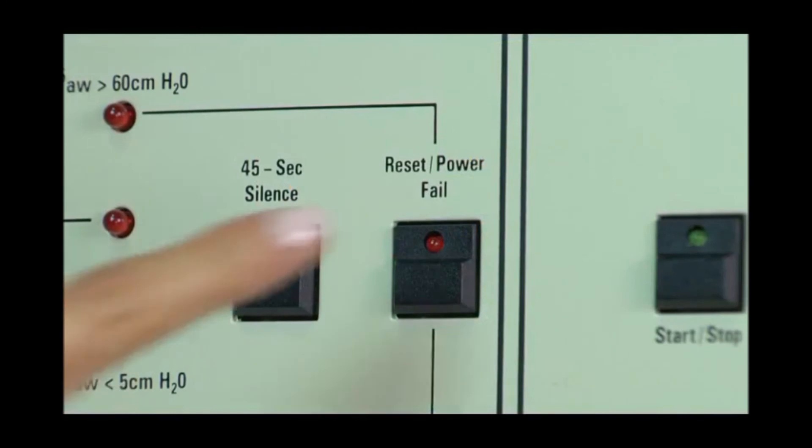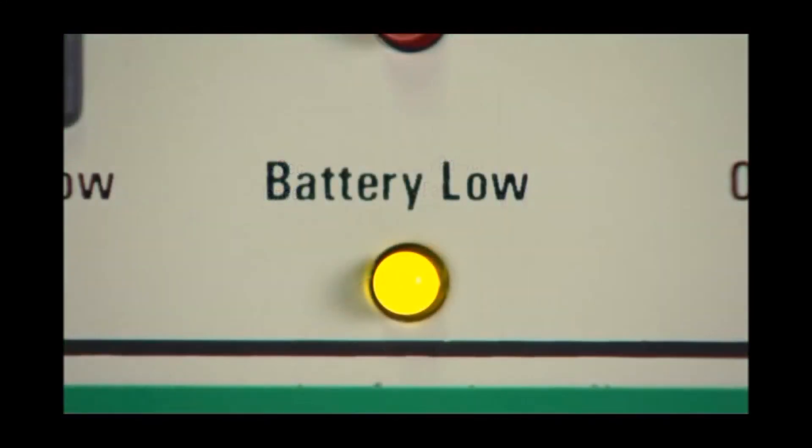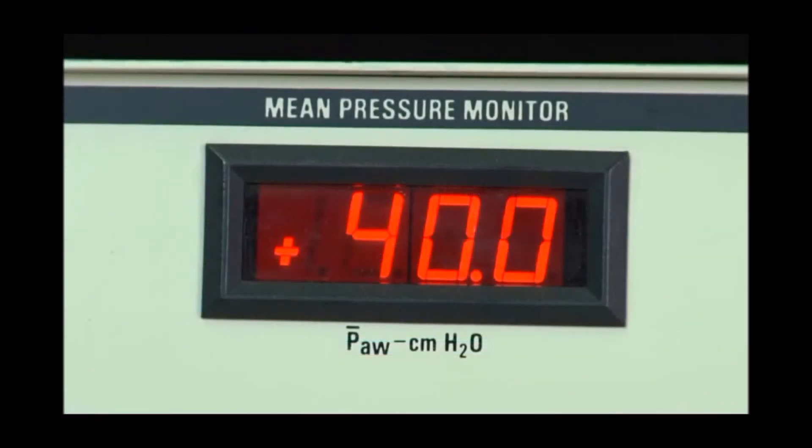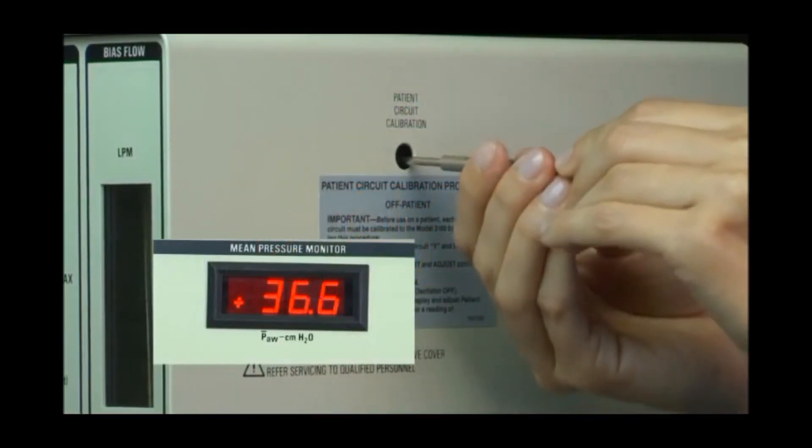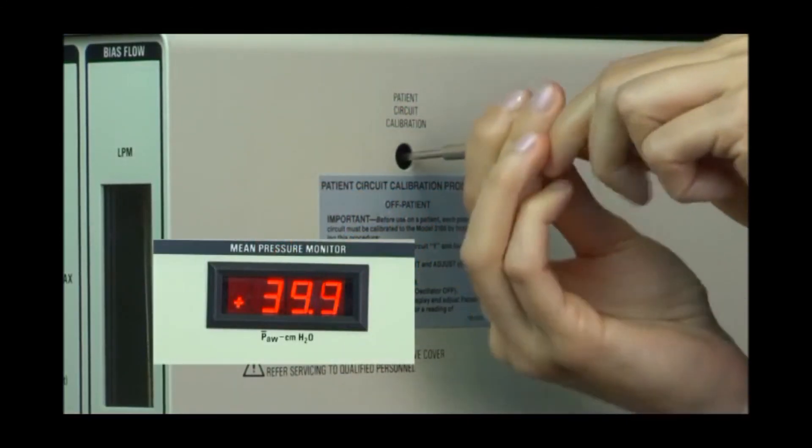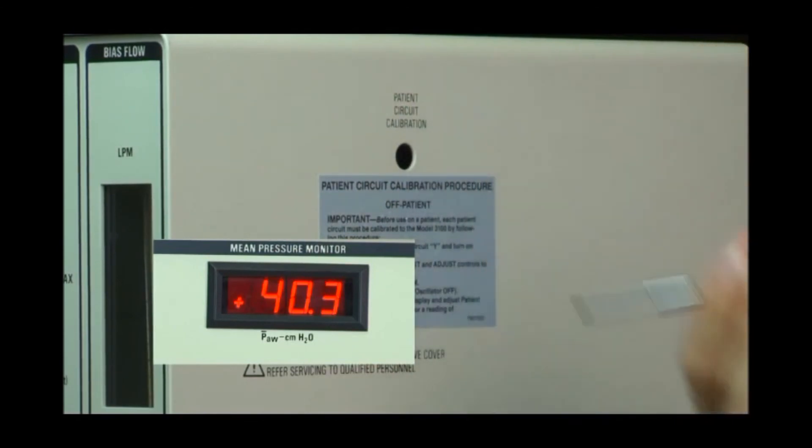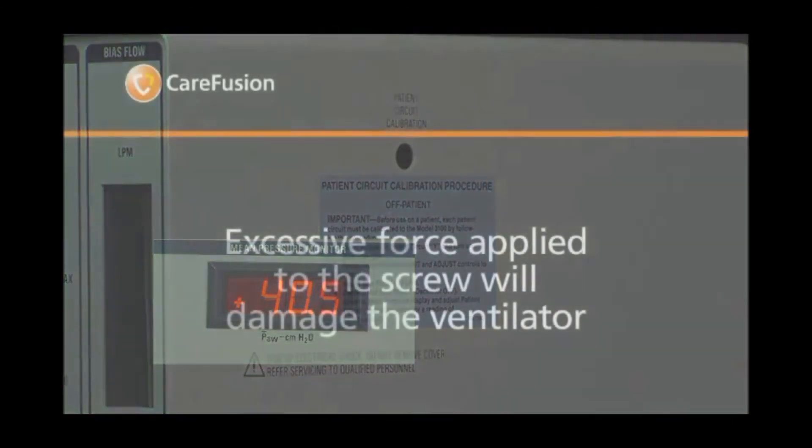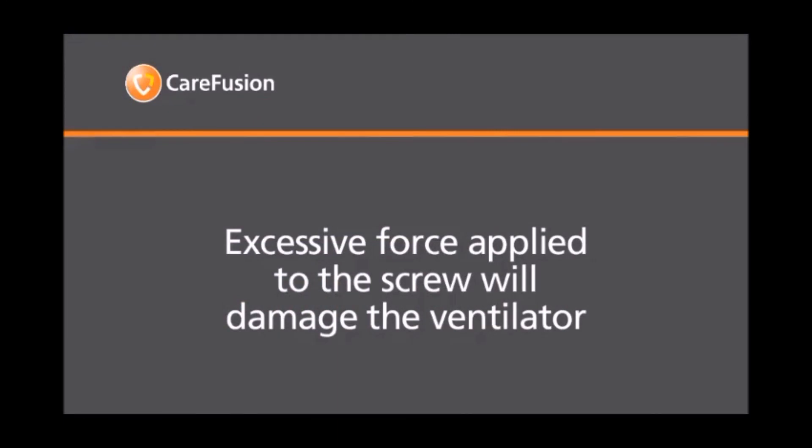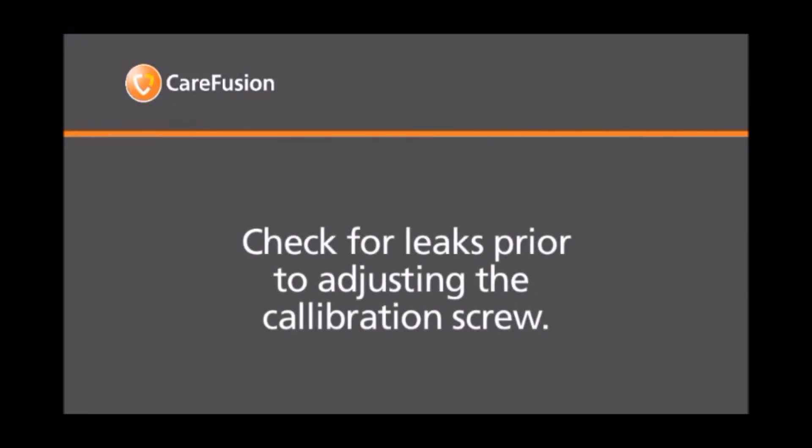It's normal for the battery low LED to illuminate when the reset button is pressed. The mean airway pressure should read 39 to 43 centimeters of water pressure. If necessary, adjust the patient circuit calibration screw shown here to achieve a mean airway pressure of 39 to 43 centimeters of water pressure. Caution should be used when performing this procedure since excessive force applied to the screw will damage the ventilator. If this pressure range cannot be achieved, remove any humidifier and check the circuit for leaks or damage.